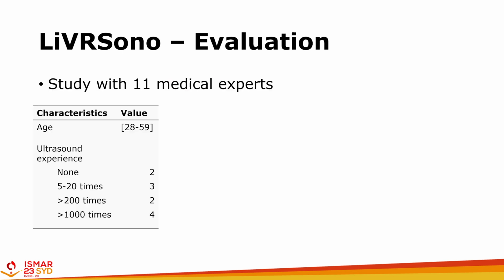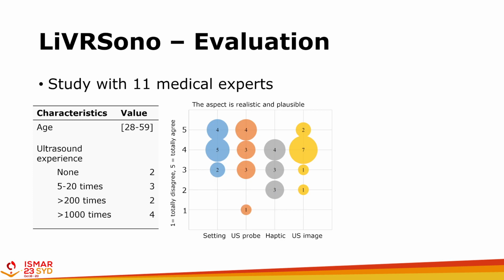We evaluated our application with 11 liver surgeons, 6 experts regarding intraoperative ultrasound, 3 novice and 2 without experience, so we had 5 potential users of this training application. In the first part of the evaluation, they were asked how realistic or plausible the setting, ultrasound probe, haptic feedback and ultrasound image are. Although the setting, probe and image are not completely realistic, they were rated quite positively and are appropriate for the learning objective.